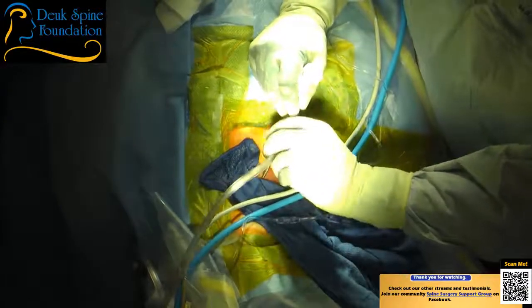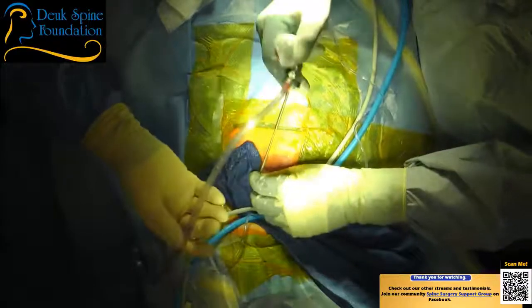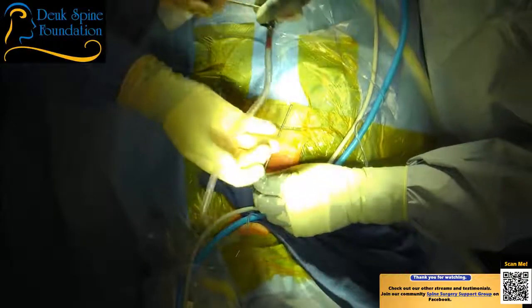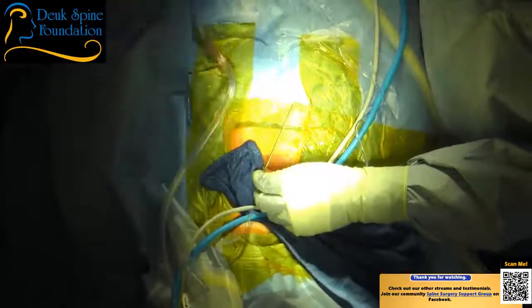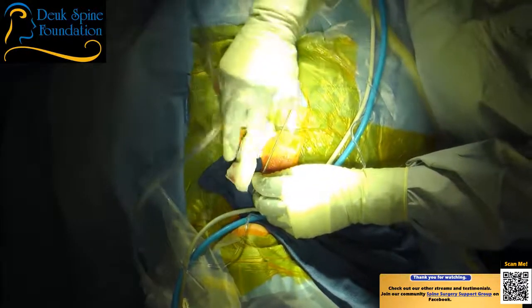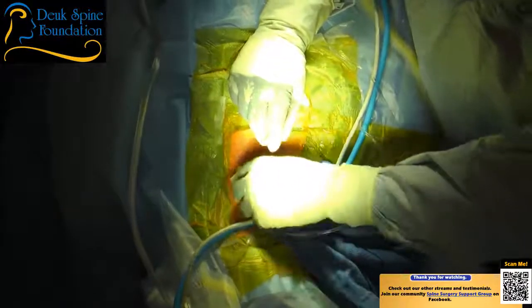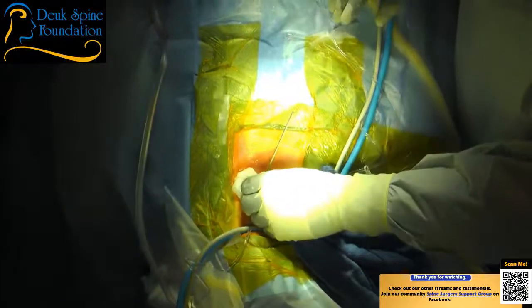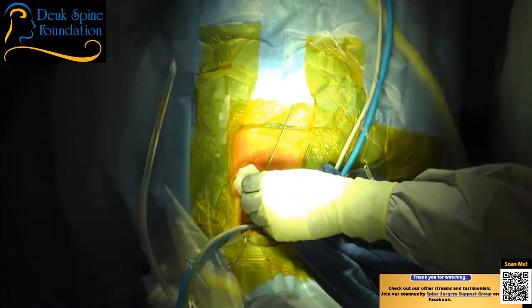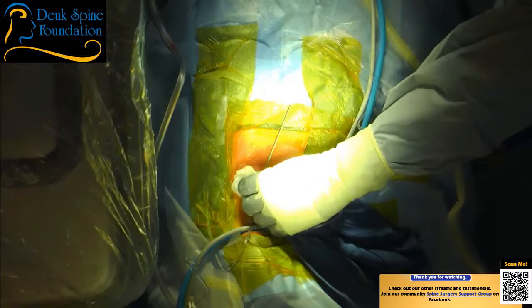So I got to take this dilator out. Take the tubular retractor out, leave the dilator, watch the laser, turn off the irrigation. All right. I'll put pressure for just a minute while we wait. Let's get the fluoro back in. You got to watch the tip of that. Release that, pull the laser back. You don't want to break the tip off.